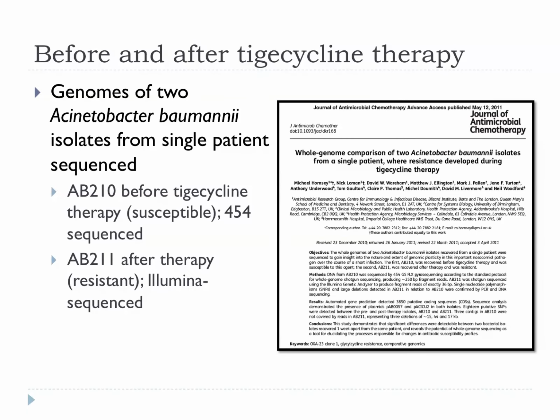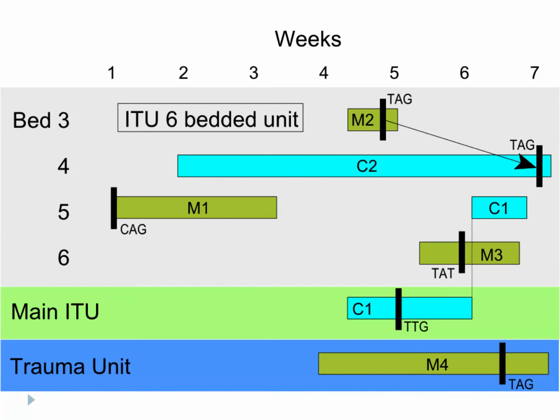So I have a quick question. How come they didn't catch the other strain from the person on the other side of the bed? The bed 5, it was also overlapped for about the same time. Yeah, well, there's a strain here that didn't transmit. We don't know why it didn't transmit. We didn't find this anywhere else.